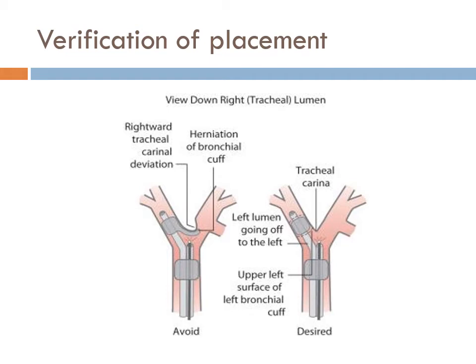Don't pull these tubes. Don't pull any tube. If you can get some type of CO2 and you're oxygenating and you're reasonably getting minute ventilation, don't pull the tube. So we didn't. Just drop the cuff, push it in further. And with the glide scope, we could all see it really go, because this kid's view was a little challenging. She had a long neck. And we pushed it in further and then put the cuff up and fixed our problems. So these cuffs can herniate as well.